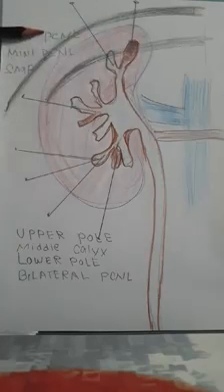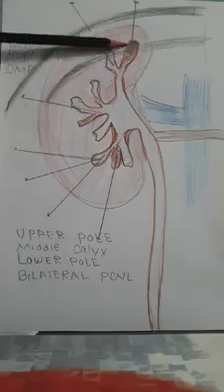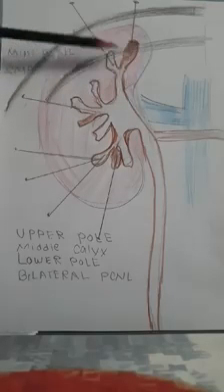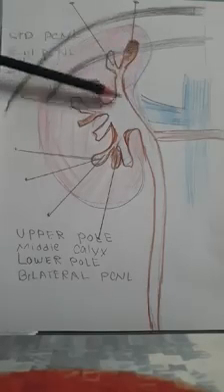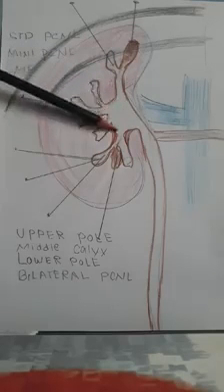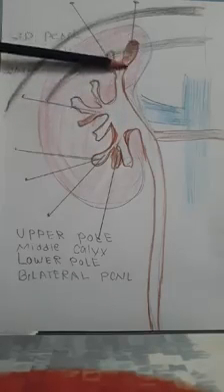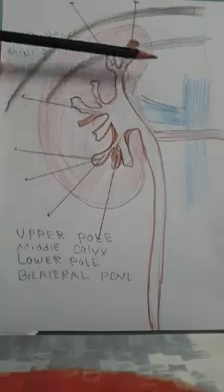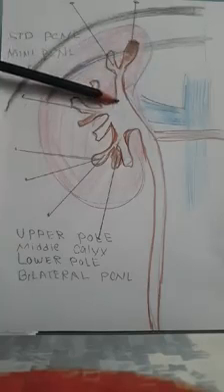Let's suppose I'm doing bilateral and I start from the right side. I do the upper pole approach of this kidney, and if my surgery is finished within a good time, there is no blood loss and there is an uneventful course, then I proceed to the other side. Otherwise, if there is some problem, I don't do the bilateral.